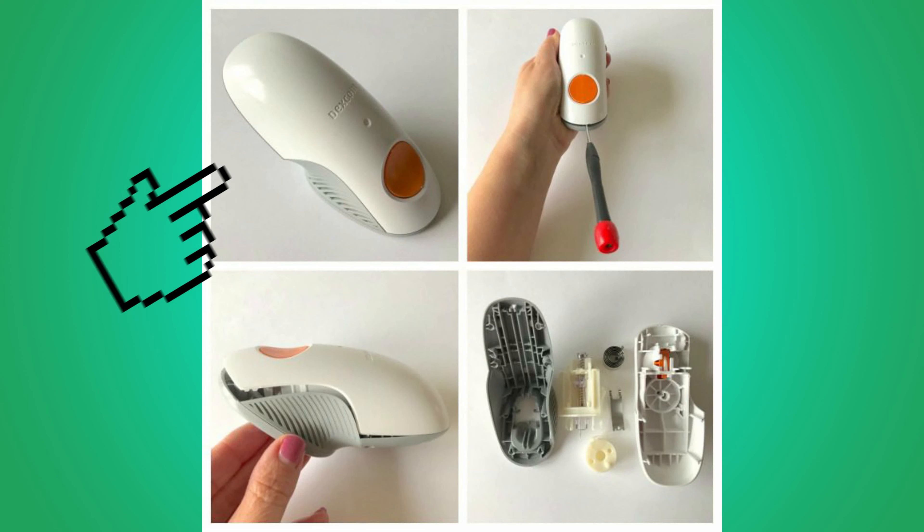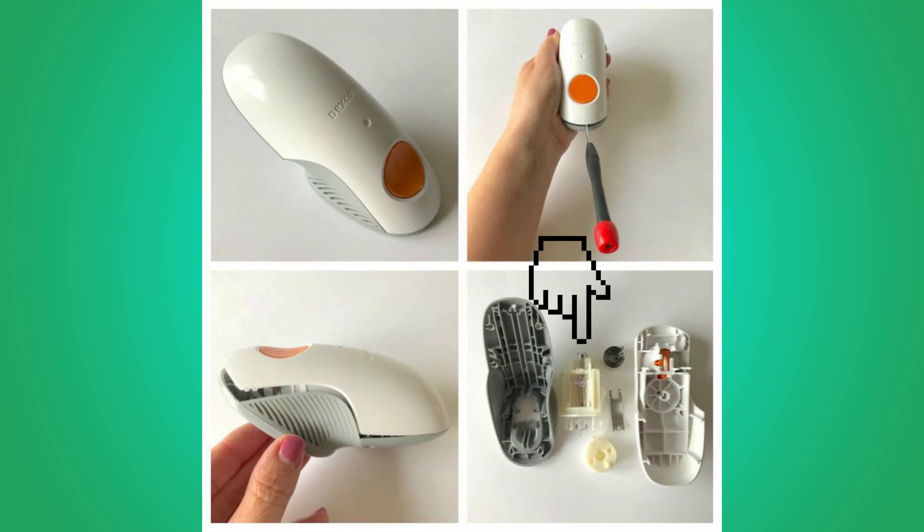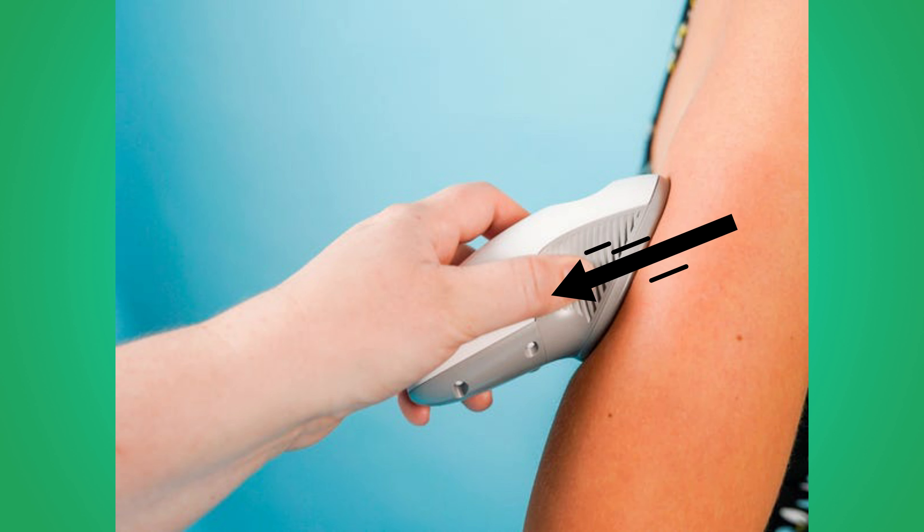A one-piece applicator — I'm super curious as to how this might work. In a two-part CGM applicator insertion, the applicator normally houses a spring that releases a needle. When the needle is inserted, it's withdrawn back into the applicator, leaving a tiny sensor wire under your skin. So how does a one-piece design manage all those moving parts? There's no projected price increase, which adds an incentive for other manufacturers to keep their prices low to remain competitive, potentially passing savings down to the consumer — we might see price decreases across the board.